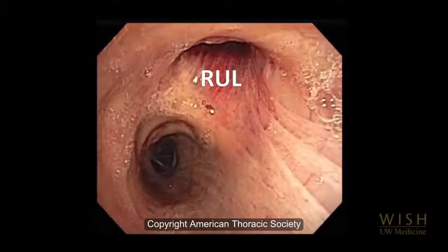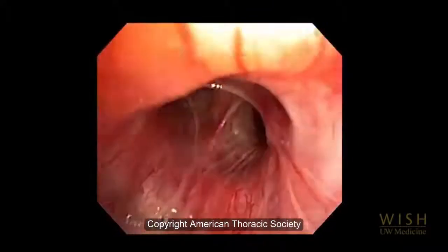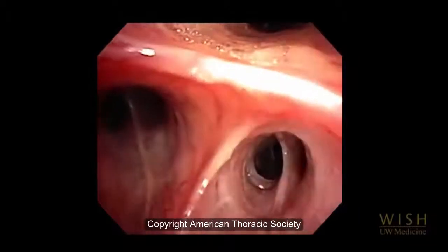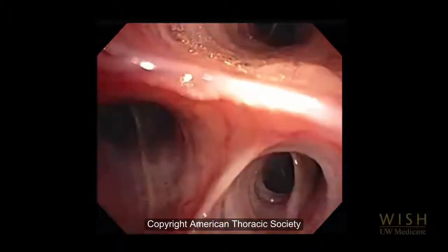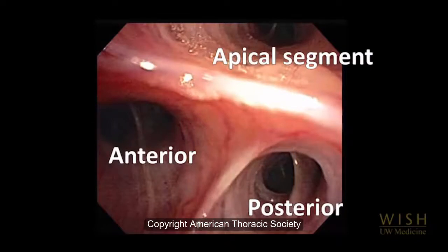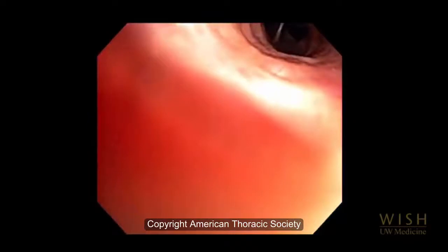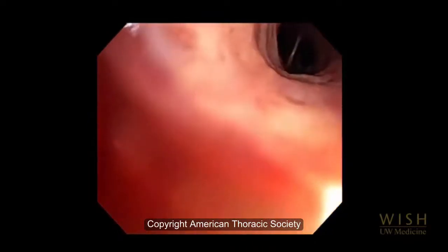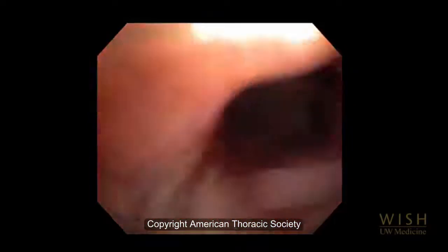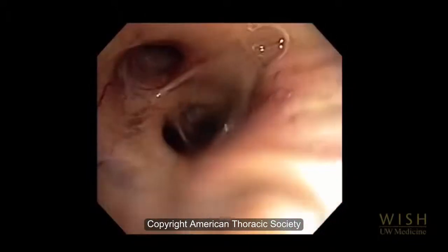The right upper lobe bronchus takes off anterolaterally. The right upper lobe trifurcates into 3 segments. It can be hard to see all of these at the same time. Here we clearly see the anterior and posterior segments. The apical segment is just visible. Now we have a better view of the apical segment. The bronchoscope returns to the right mainstem and then continues into the bronchus intermedius, which runs from right upper lobe takeoff to right middle lobe takeoff.